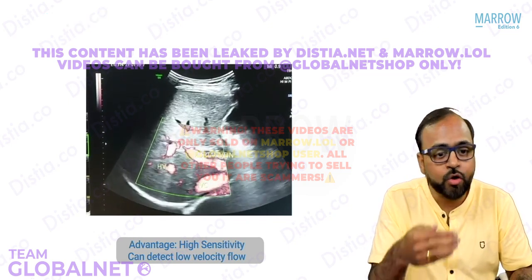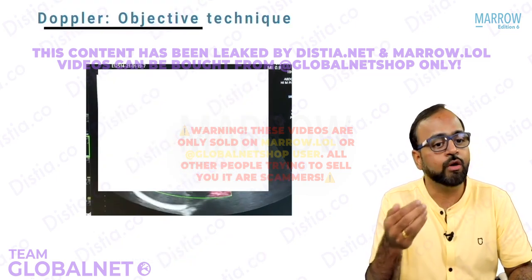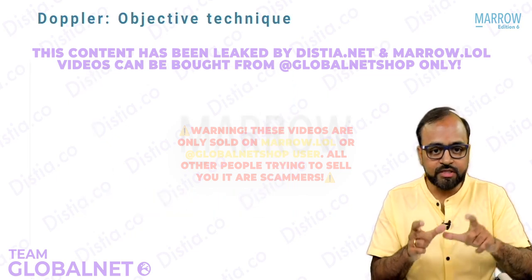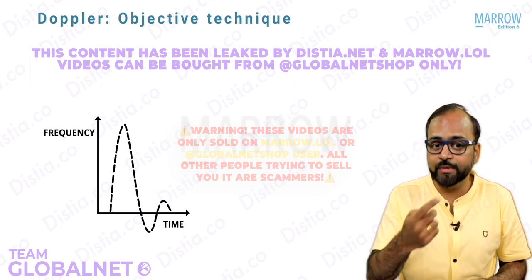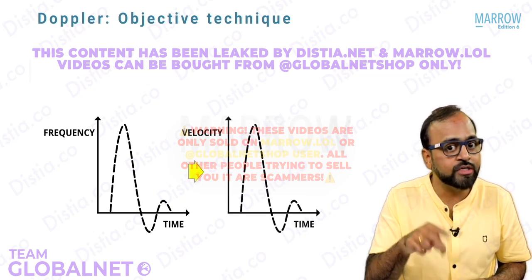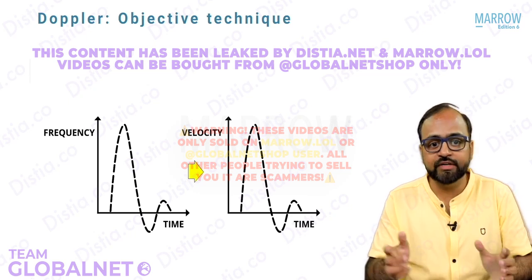And therefore there is an objective method of Doppler interpretation that is called spectral Doppler. What is spectral Doppler? Using various formulae, the machine can actually plot a graph of frequency changes occurring against time. Using mathematical formulae, this frequency information can be converted to velocity information. So I get the velocity changes happening inside a blood vessel with time.